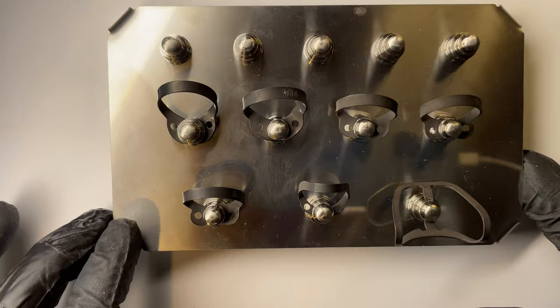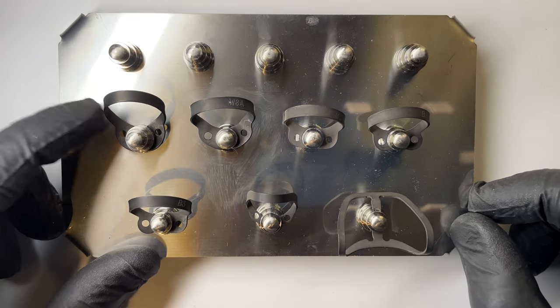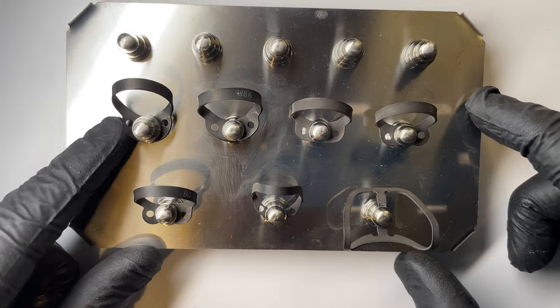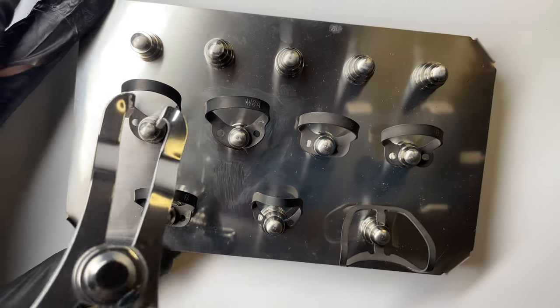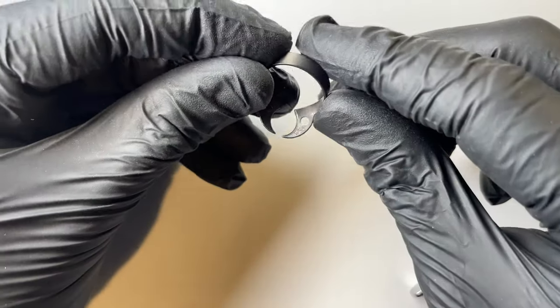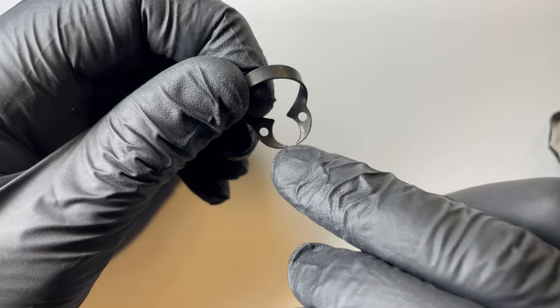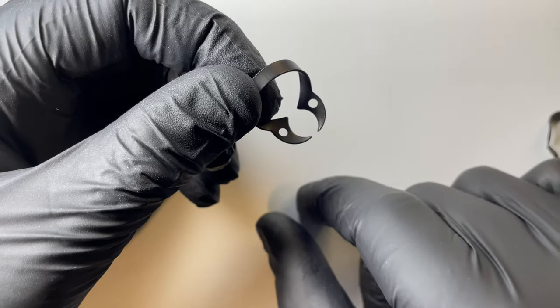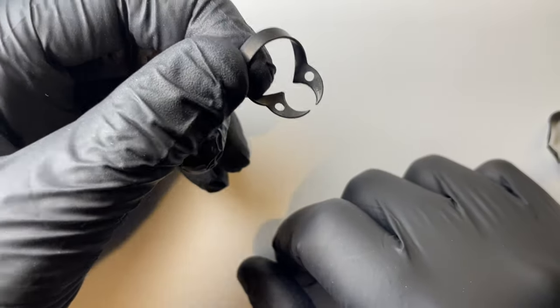Now we're on to the wingless clamps. My workhorse wingless clamp is the W5-6, and next to it we have the W8A, which is also very helpful. The W5-6 is called a universal molar clamp — excellent for upper and lower molars, and particularly good for first molars and sixes because it's quite big, so it'll fly onto those really easily. Also good for big sevens, though not for broken-down teeth.